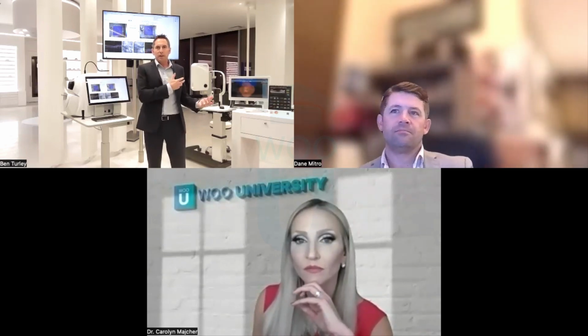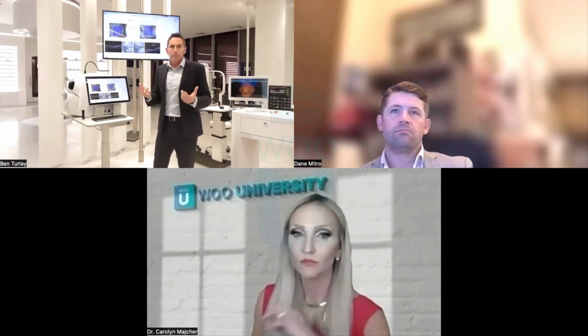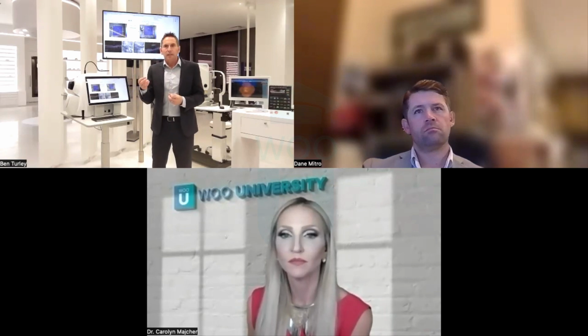And the reality is that over my left shoulder we see the CLARUS, for example. We can do our FAF, our fundus autofluorescence. We can see visually the pathology within our patients. But as you mentioned, it's the metrics, the analytics, that actually allow us to give a definition not only to ourselves to make that analysis, but also to the patient in some respects, because to the patient it's just an image.